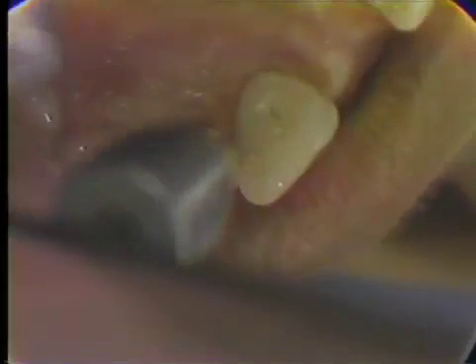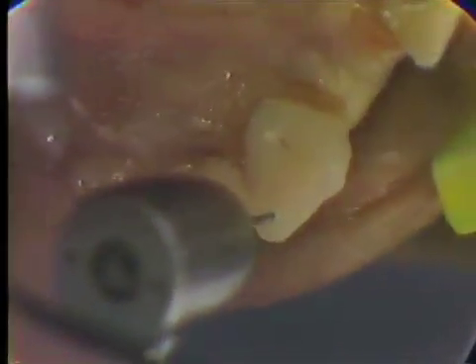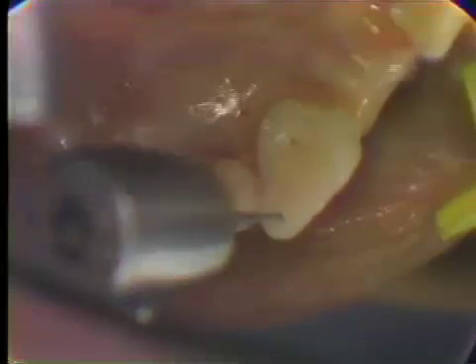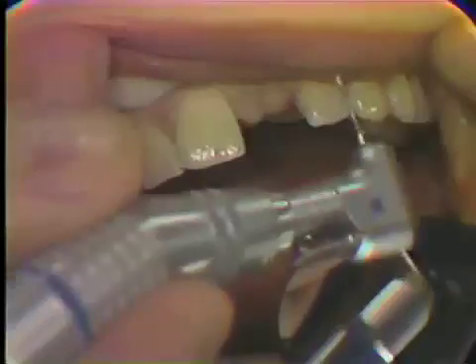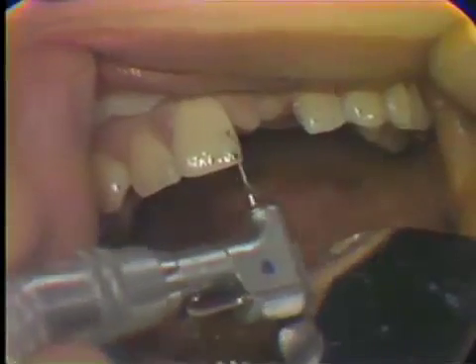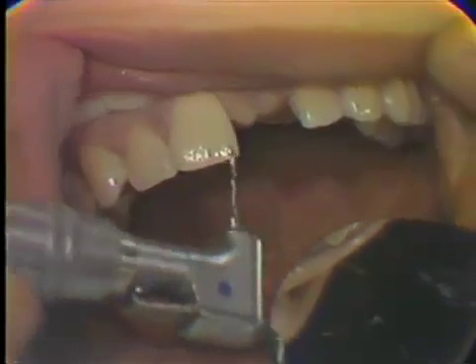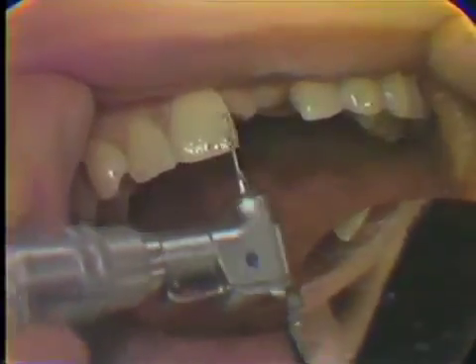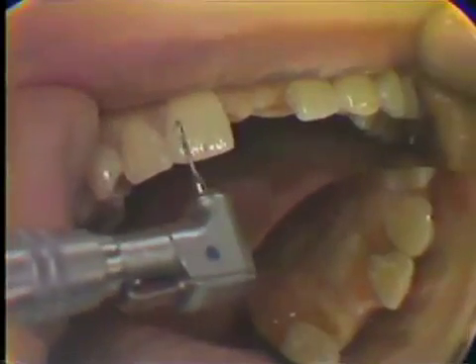The half-round burr is used to penetrate the enamel. Let's use a twist drill to survey the teeth and get the proper line of draw. By going back and forth, we can establish this. We have to be careful that we don't tilt the drill too much because we can perforate the tooth. If we tilt it too much in the buccal-lingual direction, we can also show the pin through on the enamel. So it's very important to get the proper line.